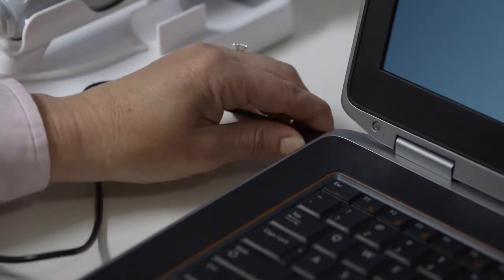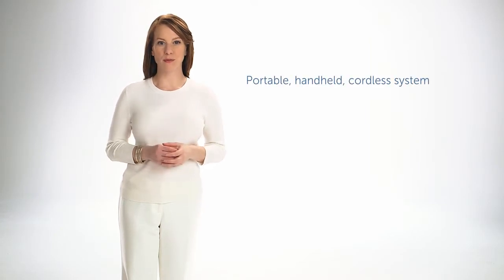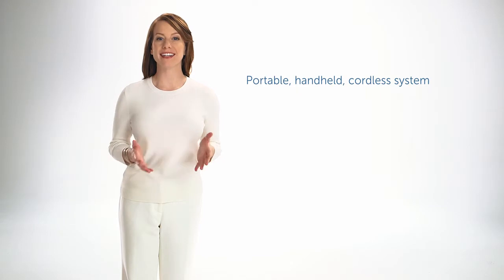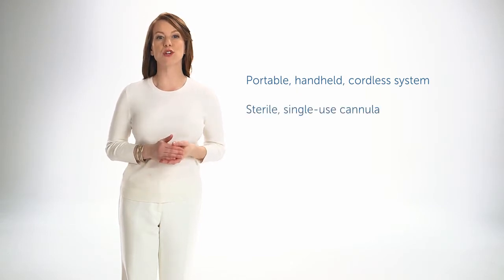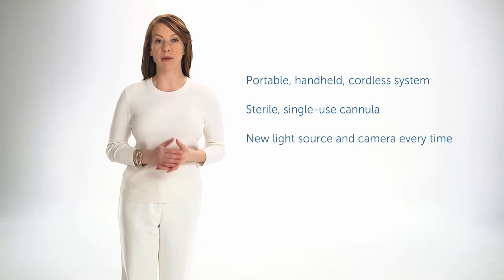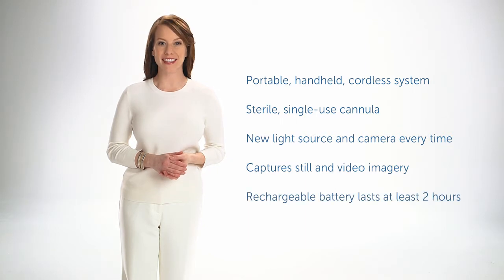To download photos and video, connect the USB cable to a computer and turn the handset on. EndoSea will show up as a device, just like a digital camera. The all-in-one EndoSea system lets you perform in-office hysteroscopy in any room, at any site. The sterile, single-use cannula gives you a new light source and camera for every patient. EndoSea captures both still and video imagery, and the rechargeable battery lasts at least two hours.